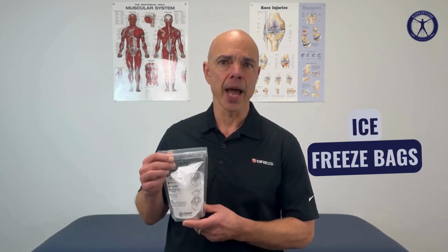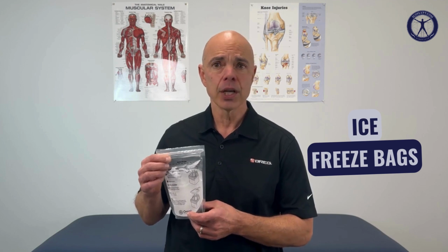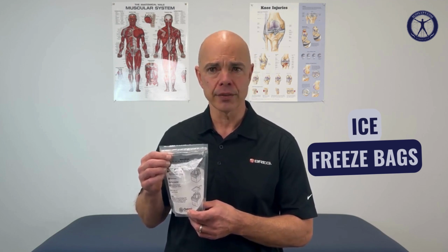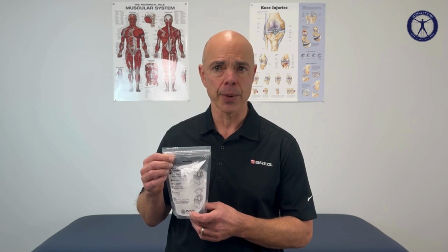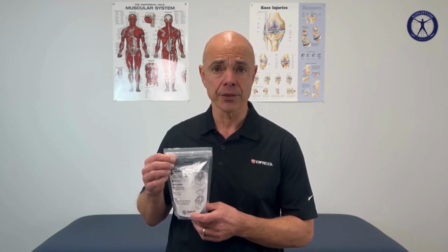As I mentioned earlier in the video, I'm going to show you our #1 trick to help make things easier for you. We have freeze bags that you can use in the cooler, and they come in packs of 12. You place 3 in the cooler and the rest in the fridge, and then you just keep rotating the bags. This way, especially if you're alone, you don't have to keep chasing after ice, and your refrigerator will have a really hard time keeping up anyway.